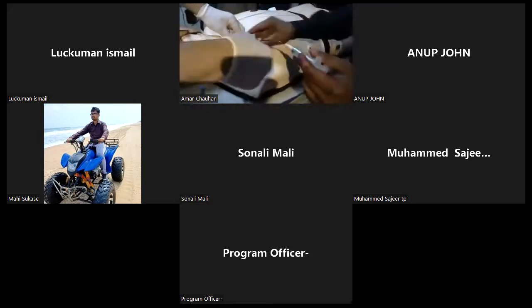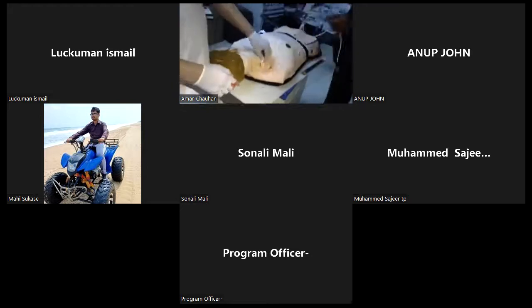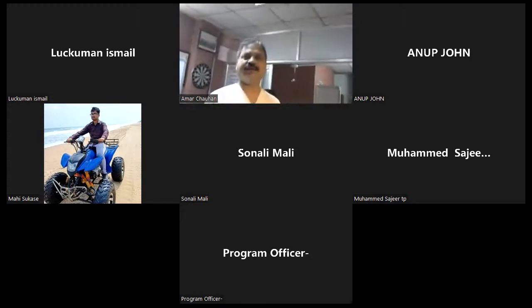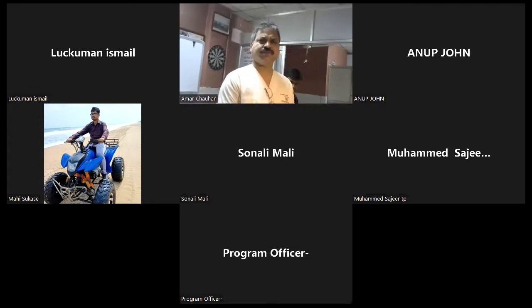You can practice. Okay, Lukman, what else is left? Lukman, sir, what else is left? Now stop the bleed. Okay, stop the bleed.